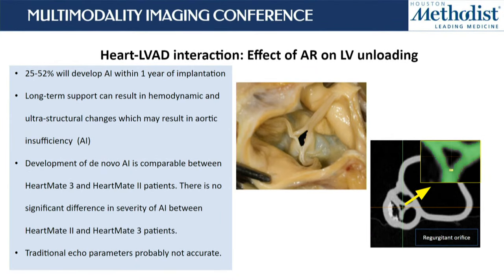What we really can discriminate is patients with mild AR versus severe AR, basically the extremes, and then you have to corroborate that with your hemodynamic studies. If they have high filling pressures and are coming in with recurrent heart failure admissions to the hospital, and they have a big, rip-roaring aortic regurgitation hole. This process basically happens with commissural fusion. So what you form is a central aortic jet in most cases, unless you have infective endocarditis, and then you can have multiple holes. I do use CT for this purpose.